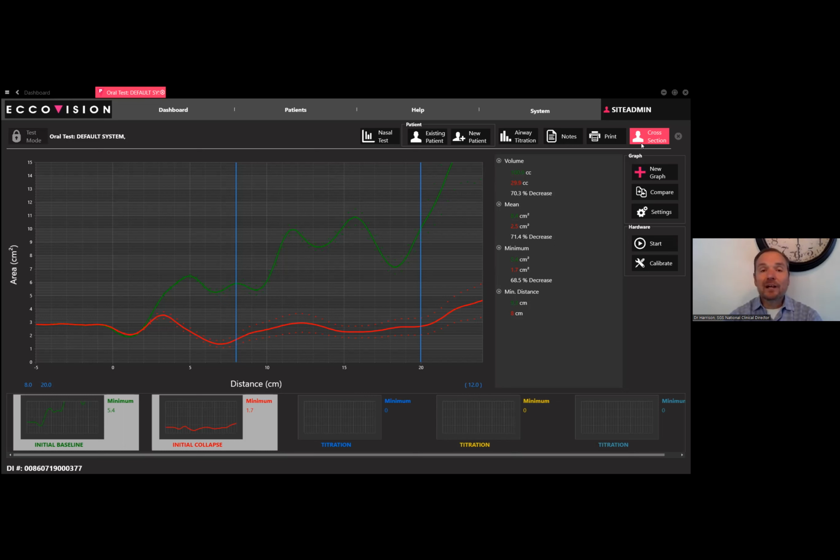Dark room, heavy blanket. There's some debate on blue light and screen time going on. These are all things that we're aware of. To me, it's fascinating. I just think it's such an easy tool to begin implementing, to have something to back what it is that you're saying to the patient, especially for the patients who are hearing for the first time that they have some kind of airway issue going on. And, like you said, to incorporate it via the hygienist, the assistant, or the doctor, whoever it might be, it's good to have that supporting tool to reiterate everything.